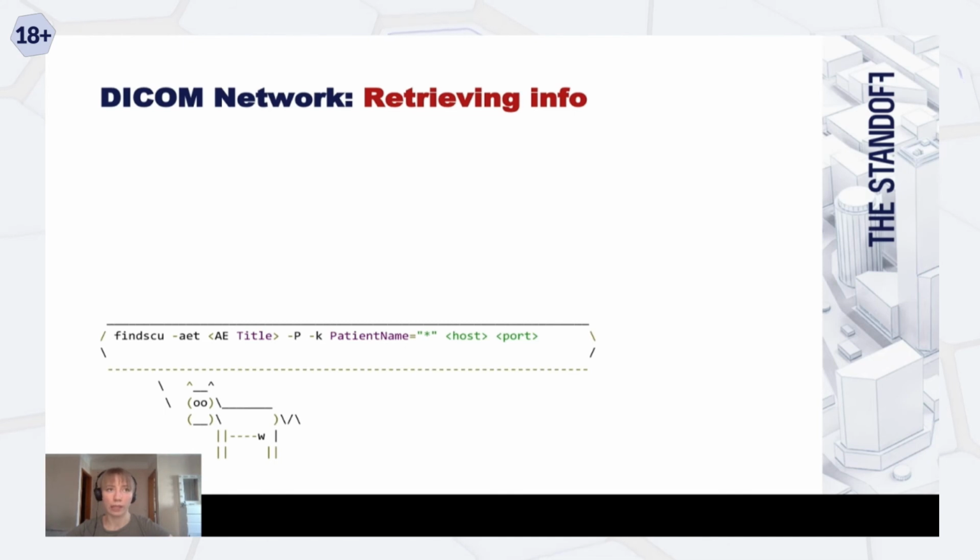Application entity title is access control when DICOM server is used by two different systems, but they have got the same DICOM server, and the DICOM server can have a collection for different systems. It's also a method of identifying the client, those who would like to get access to DICOM studies.